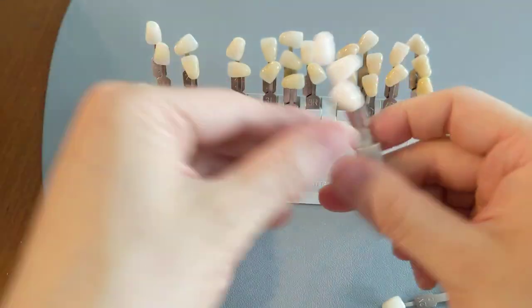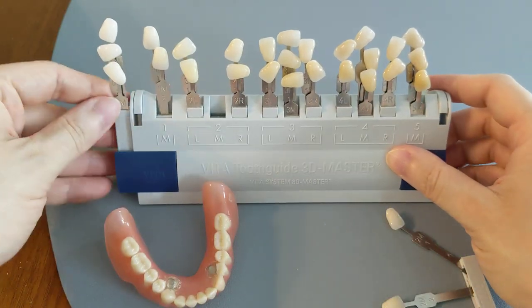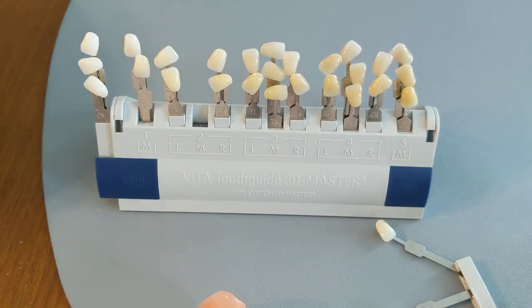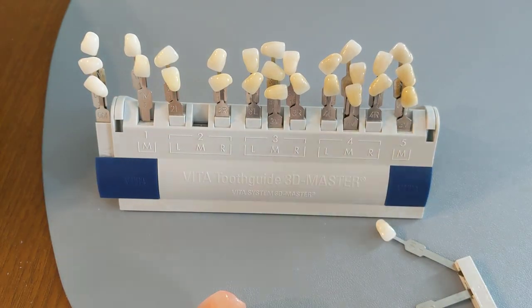You can get your denture teeth in any color you want on this guide — they are all fair game for your denture teeth. So that's the end of what's the whitest denture color.